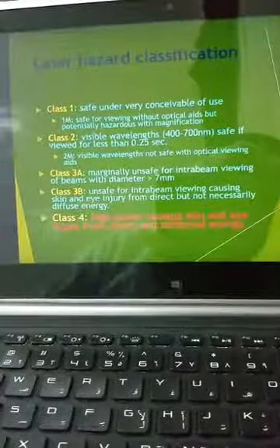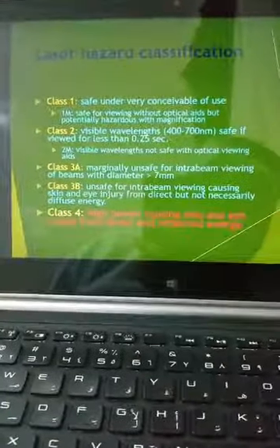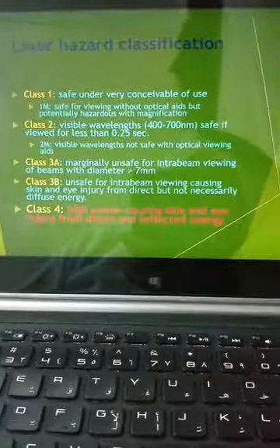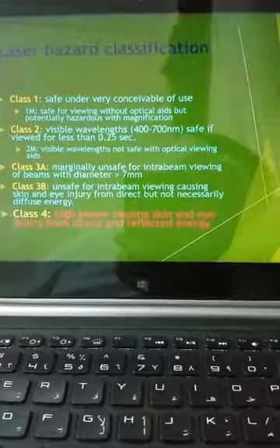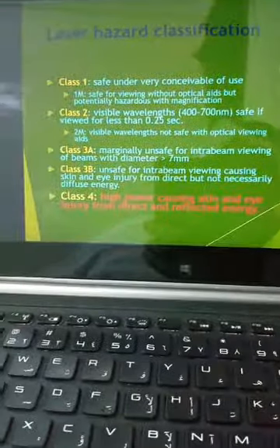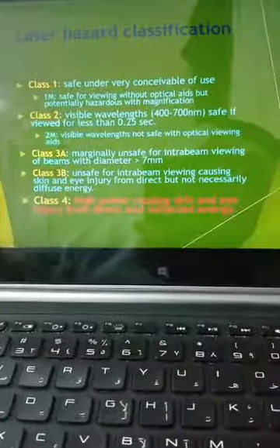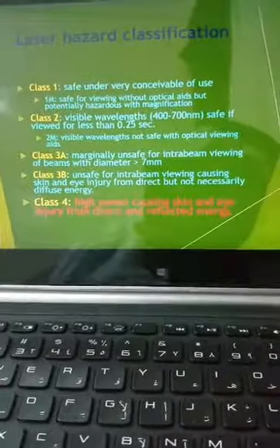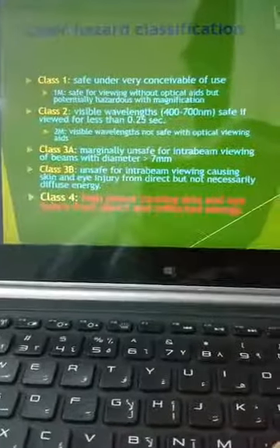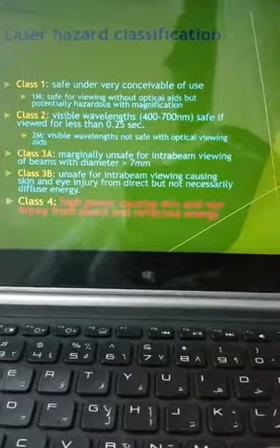And to buy a machine, this is not enough. You have to learn more about laser physics. I have seen cases where companies are selling machines and representatives are causing damage, especially if they are dentists who are not aware of laser and are just selling lasers, and they have seen cases like that. So we have to be careful about this type of laser.